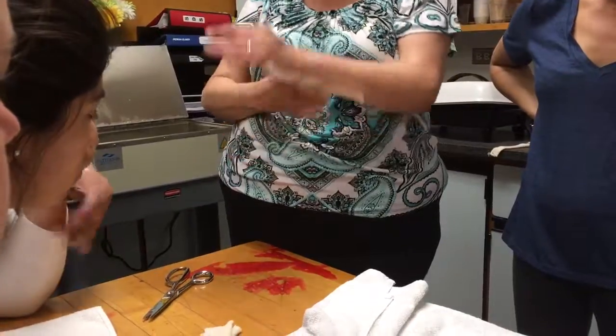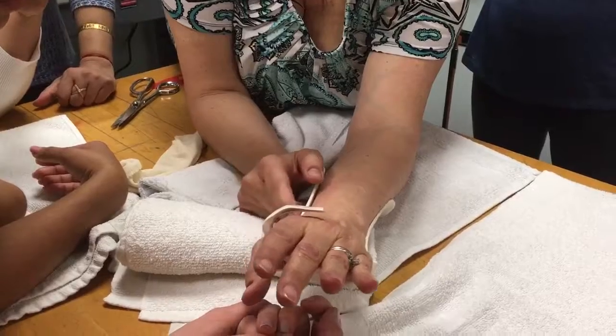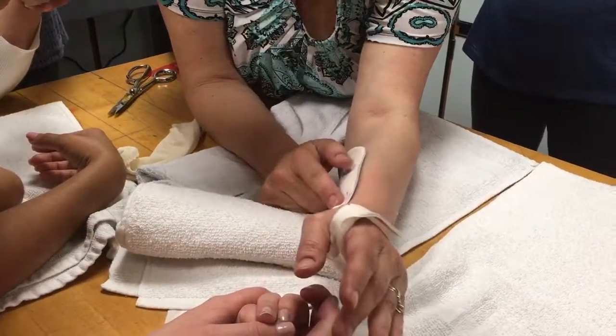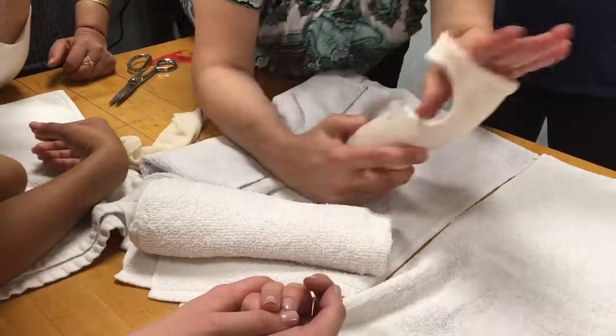You see that? It's still a little... Right here, I don't like it right here. If I'm making this for a patient, I'm cutting that off. I don't like it.